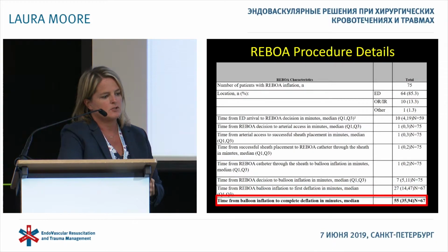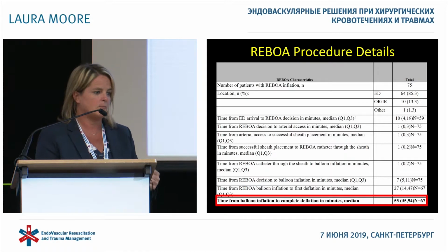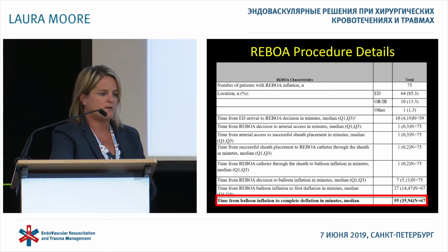And then finally, in terms of times, the other thing everybody always wants to know about is how long can I leave the balloon up? Again, median inflation time from the time it was inflated till the time it was completely deflated was about 55 minutes. There's certainly a range in there, 35 to 94 minutes.